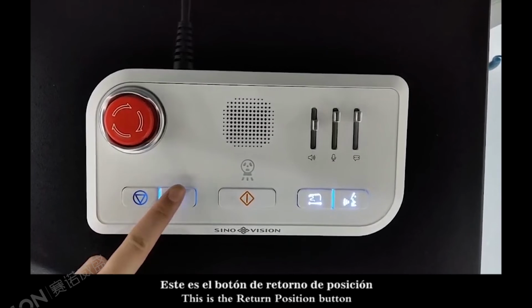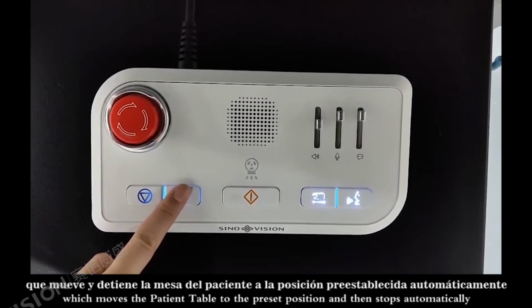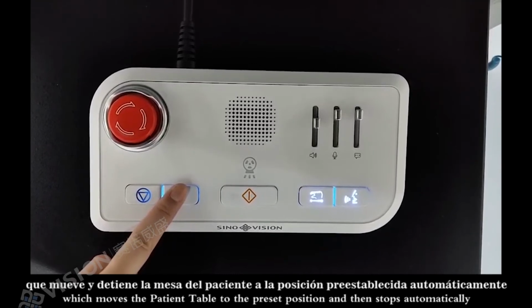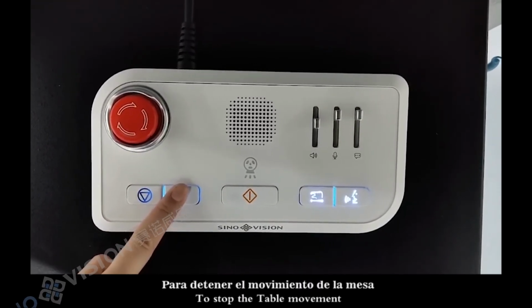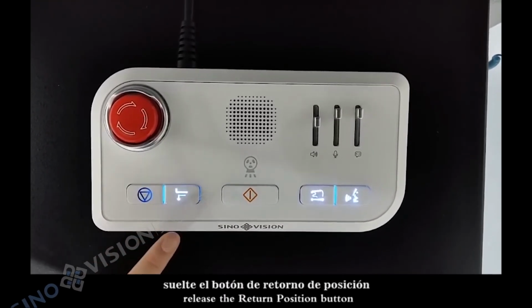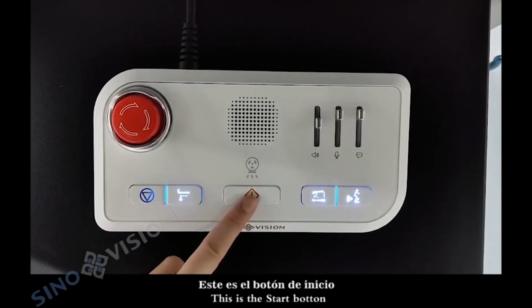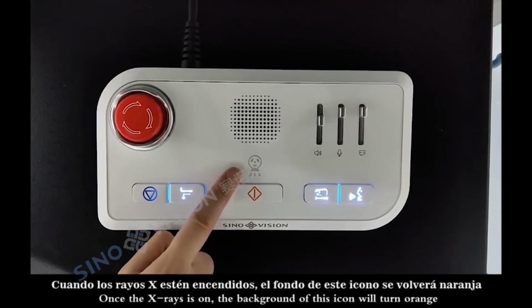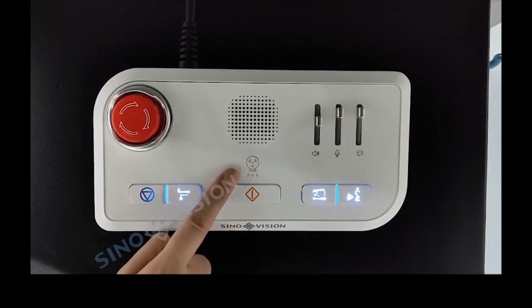This is the return position button, which moves the patient table to the preset position and then stops automatically. To stop the table movement, release the return position button. This is the start button. Once the X-rays are on, the background of this icon will turn orange.